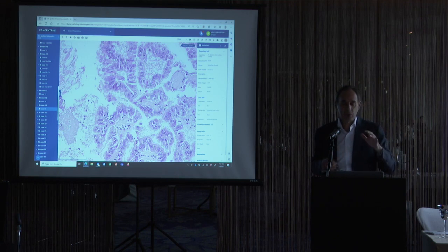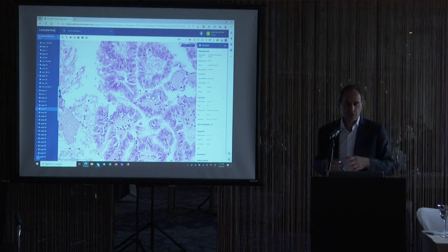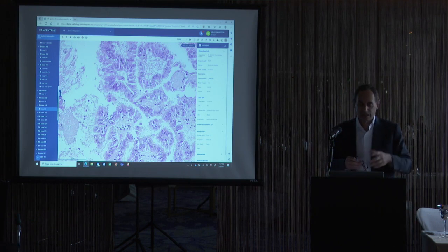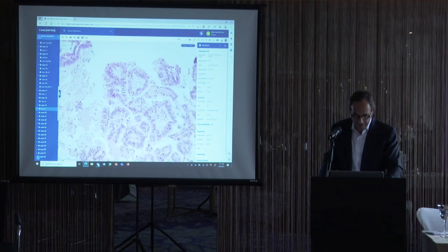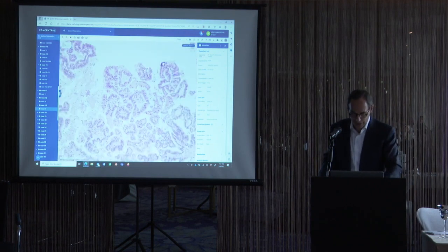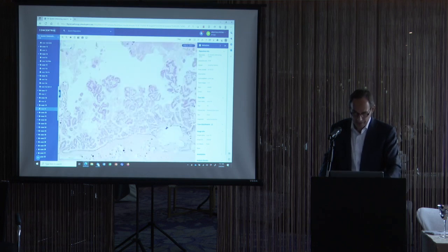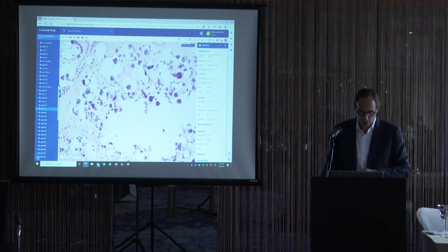Both paratesticular, and less commonly intratesticular, you can see the full range of Mullerian lesions that you would see in the ovary. You can see serous, mucinous, endometrioid, clear cell. It can be benign, adenofibromatous, borderline, frankly malignant. This case, I often share with the GYN pathologist. It is considered to be a papillary serous borderline tumor. It has nice little calcifications, classic for a serous tumor as well.